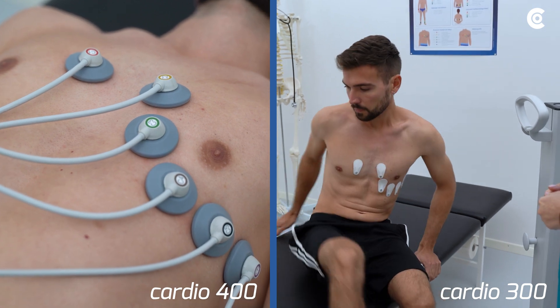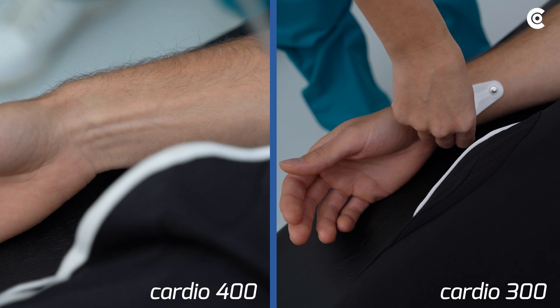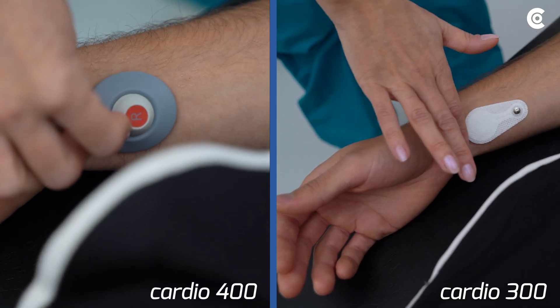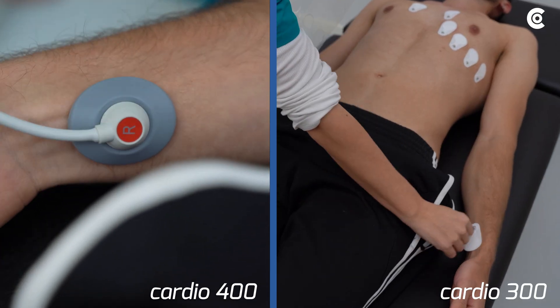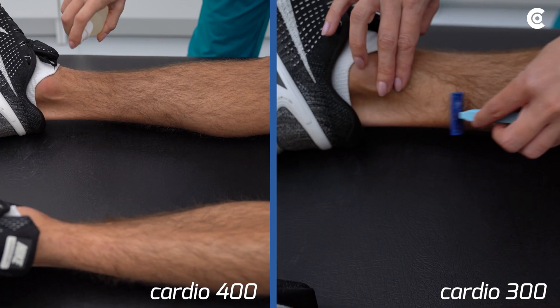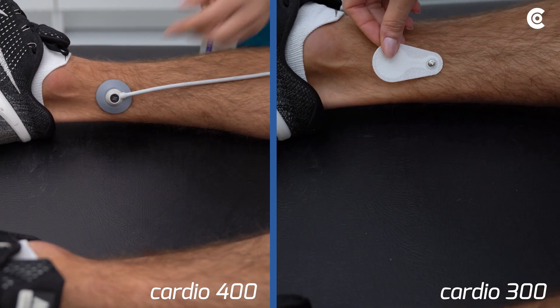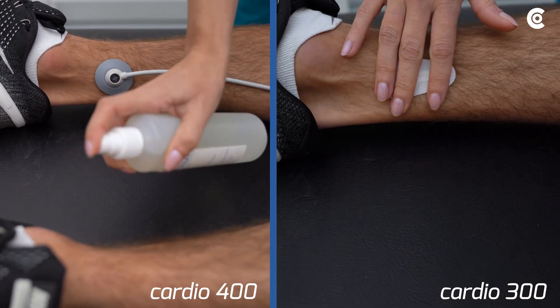Place the limb leads in the next step. The electrodes with the labels R and L must be placed on the right and left arm. Electrode N is placed on the right leg, and electrode F is applied on the left leg.